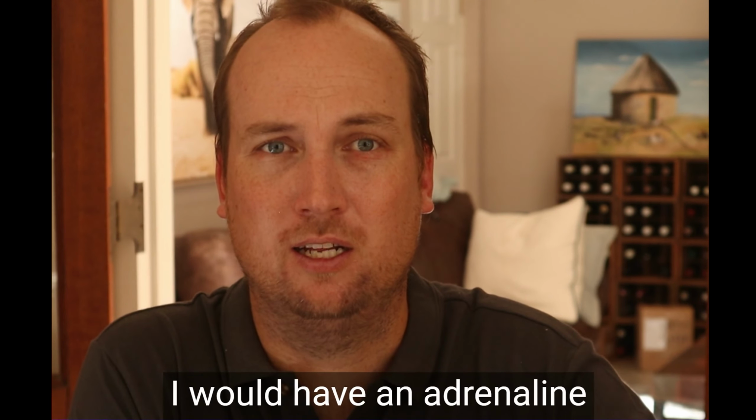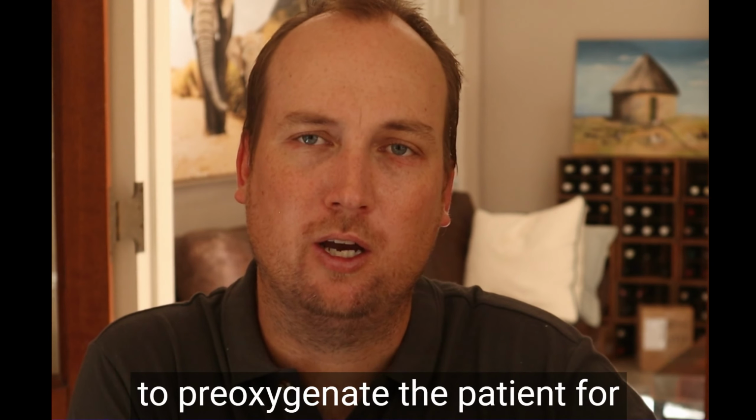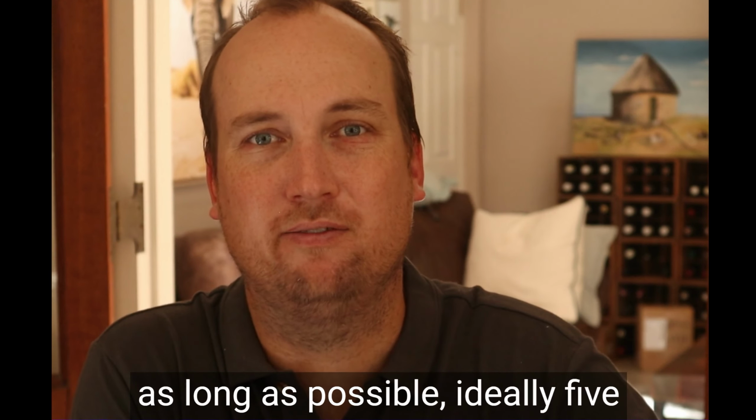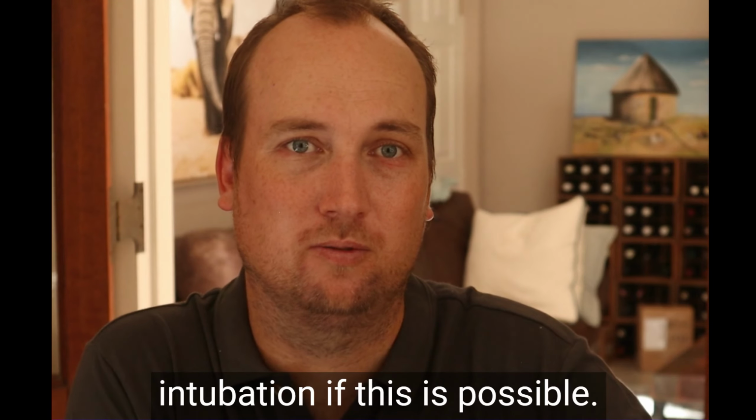I would have an adrenaline infusion ready, and I would also have 1 amp of adrenaline mixed in a 20 ml syringe of saline ready for intravenous boluses of 50 to 100 micrograms at a time. We want to use an ambubag to pre-oxygenate the patient for as long as possible, ideally 5 minutes before induction and intubation, if this is possible.